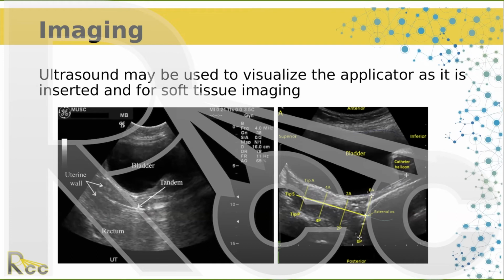But I'd be remiss if I didn't also share about ultrasound. Ultrasound's been going on for a long time, and it's been a proven method. This is another one of those imaging modalities that's very highly user dependent. It takes a skill, but if you have that skill, and if you've worked to develop it, ultrasound can be useful in visualizing the applicator insertion and making sure it's where you want it to be.